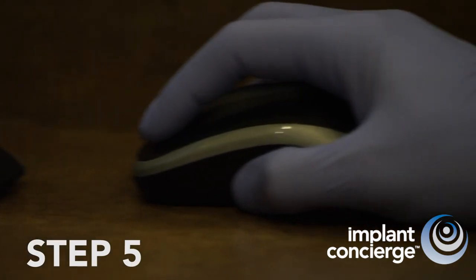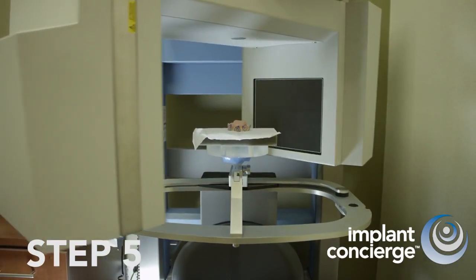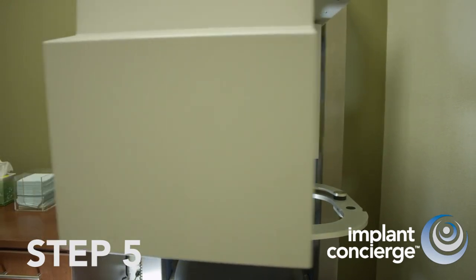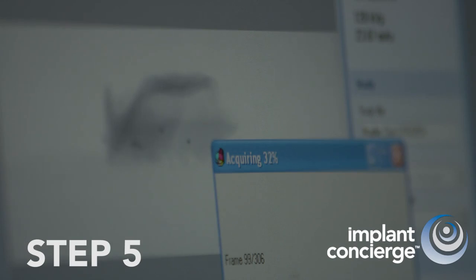Step 5. Take a Cone Beam CT of the denture. If allowed, select a single arch scan, approximately 6 centimeters and at 0.4 voxels. A high-resolution scan is not desired or necessary.